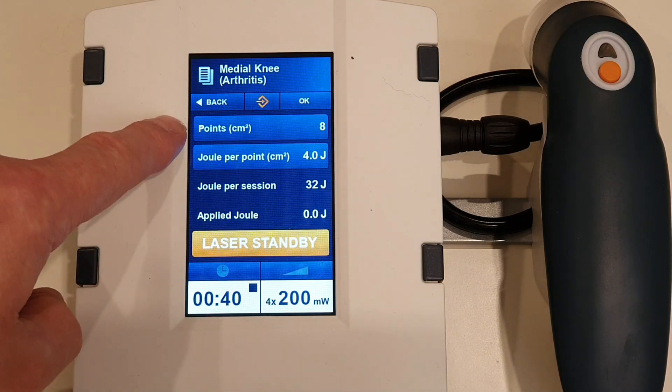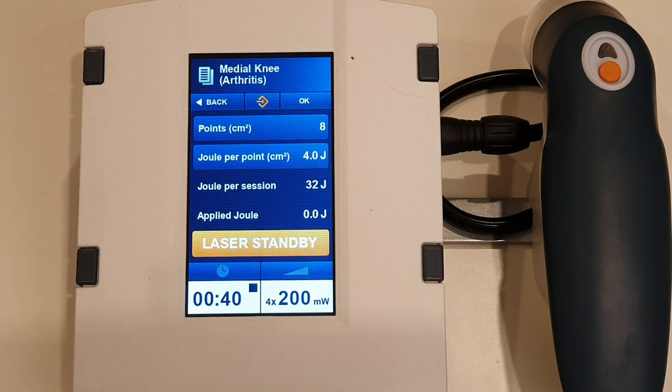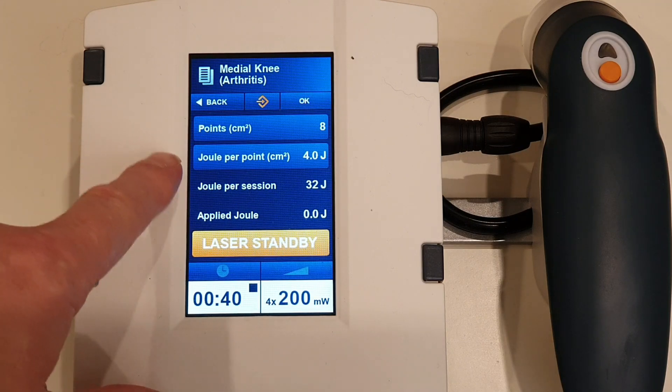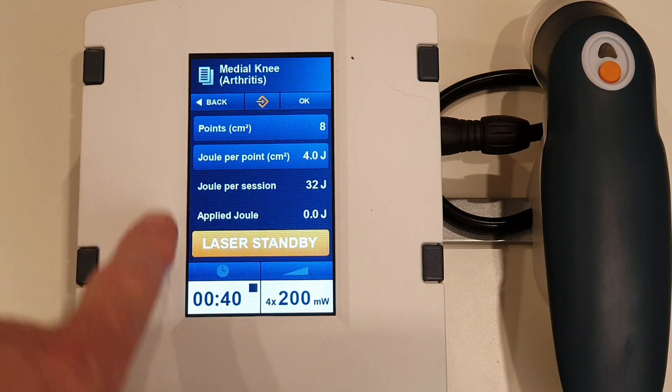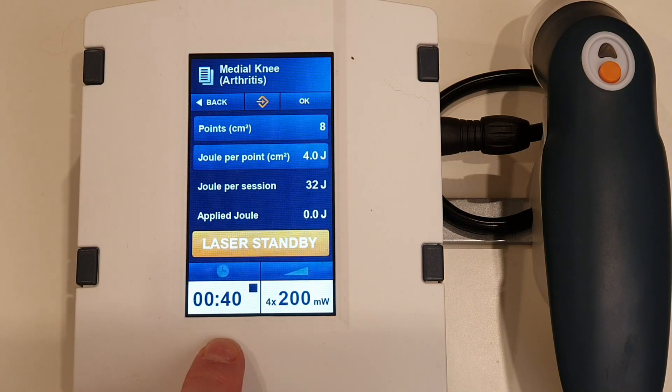You'll see here it says we're going to do eight points. What that means is we've got a cluster with four laser diodes in it, and to get eight points we're going to have to do two spots — four plus four — so we're going to be moving the probe. Joules per point is going to be four joules per centimeter squared, which would be in line with the WALT guidelines. Total joules per session: 32 joules. So it's going to be 40 seconds, divided by two because we're doing two spots — 20 and 20 — and we've got four times 200 milliwatts.